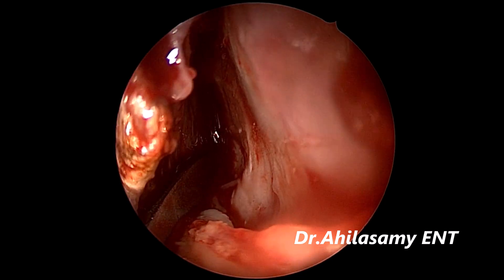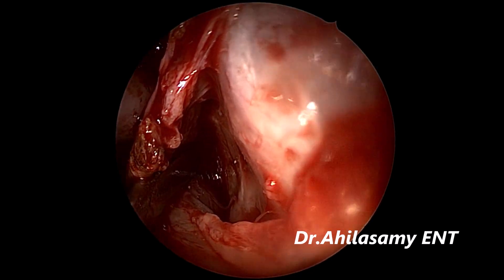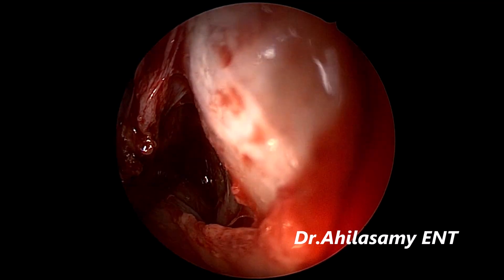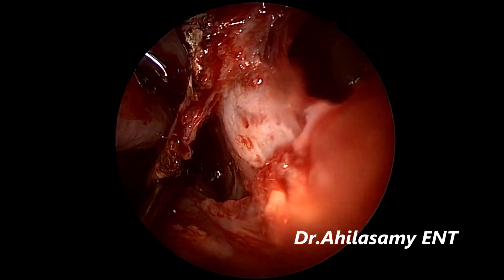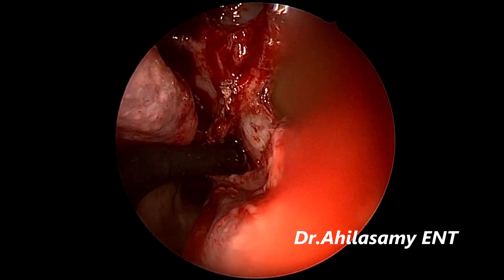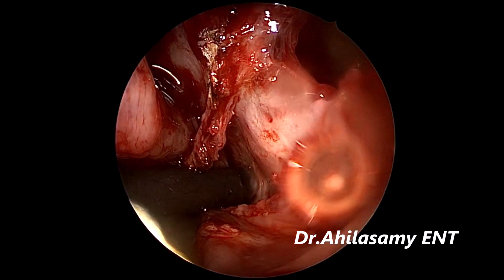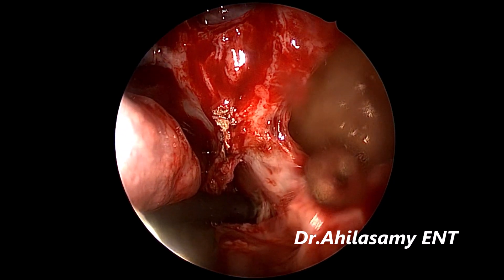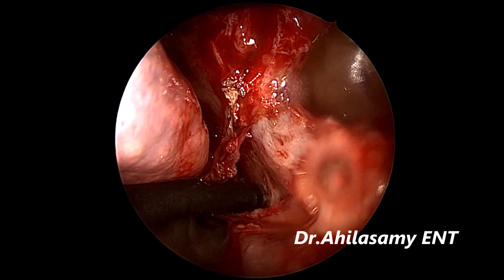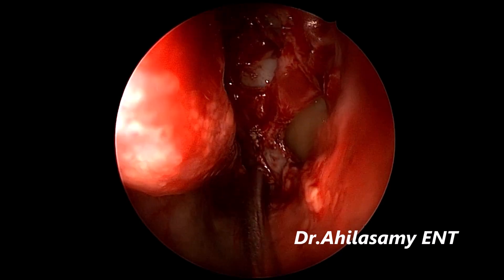The posterior superior nasal nerve — you can see I am stretching it. It is coming some 5-6 mm below the crista ethmoidalis. Superiorly that is the sphenopalatine artery. So you can just cut the nerve or coagulate it. The patient will be relieved of allergic symptoms like rhinorrhea and sneezing post-operatively. Now I am using bipolar to coagulate the nerve. You can appreciate the field quality — hardly any bleeding under local anesthesia. These nerves are very slender and can be easily appreciated under local anesthesia; in general anesthesia it is sometimes very difficult when the field is bloody. Then replacing the flap.